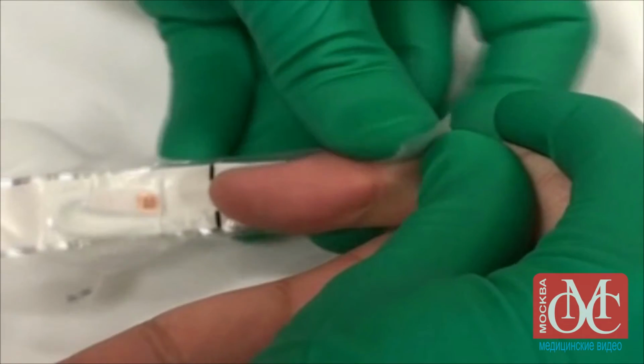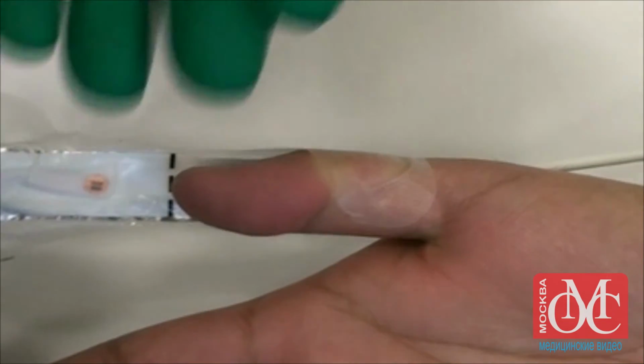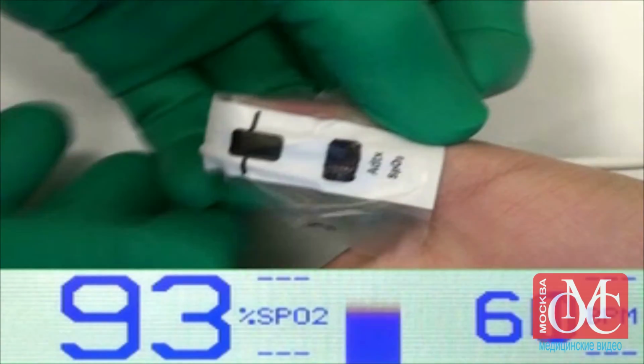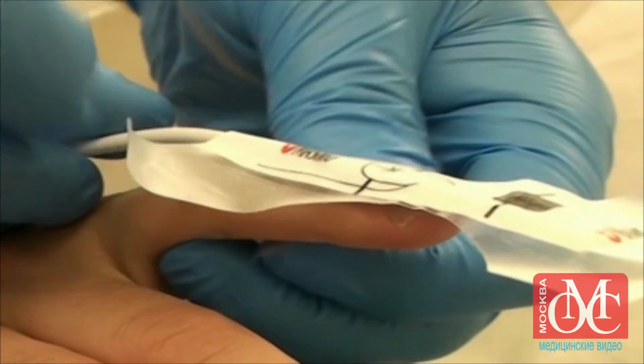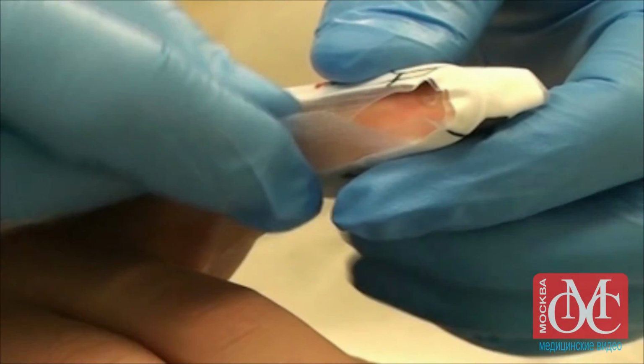Venous pulsations may occur if a probe is too small or is placed too tightly on the finger. These venous pulsations will produce interference, resulting in a falsely low pulse oximeter reading. Pulse oximeter probes with adhesive sensors may minimize motion and may yield more accurate results than non-adhesive sensors.